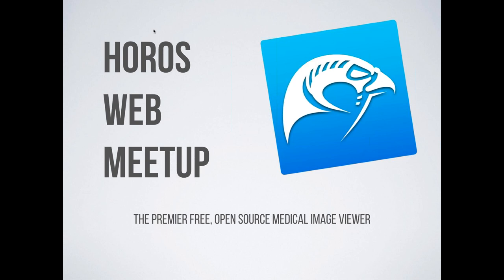Today's webinar really focuses on providing you with a very high-level introduction to Horos, what we're trying to do here at the Horos project in terms of making available a premier free open source medical image viewer.